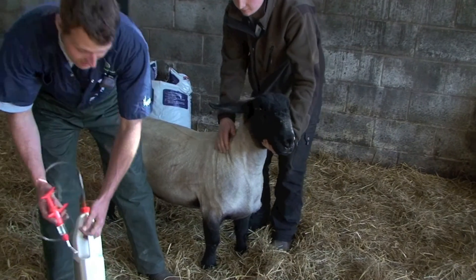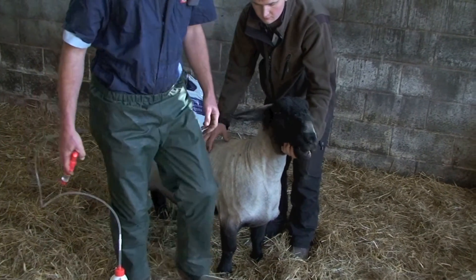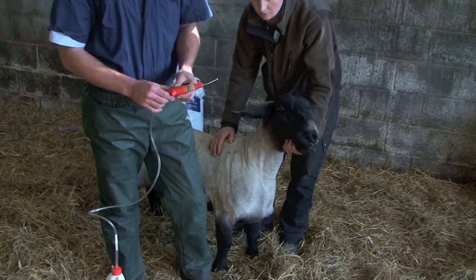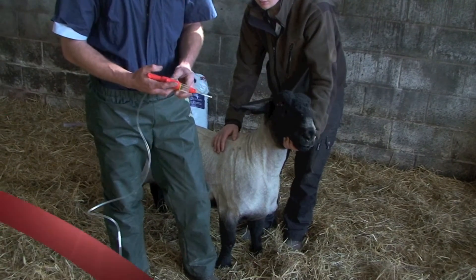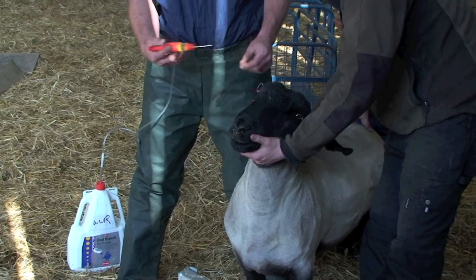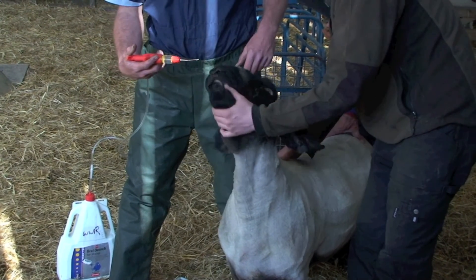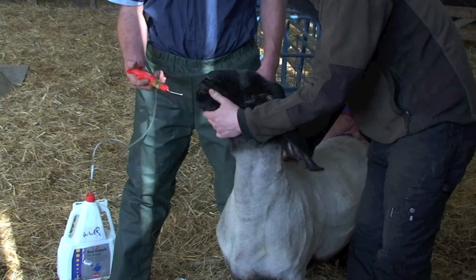Now you've got the weight of the heaviest animal in the group, set your gun accordingly so you're dosing for slightly heavier than the heaviest animal. The correct way of drenching sheep is to put the end of the nozzle over the back of the tongue — that way the sheep can't spit any out and it's getting the full dose.